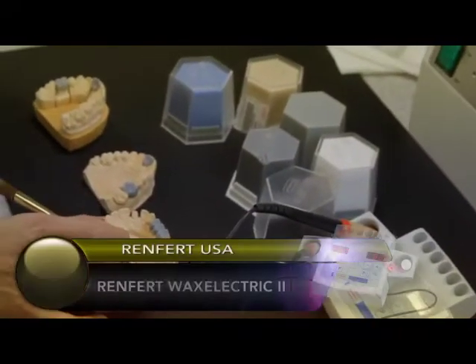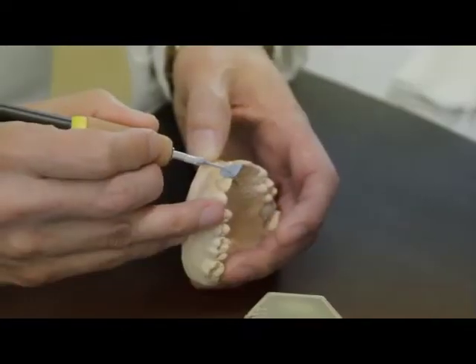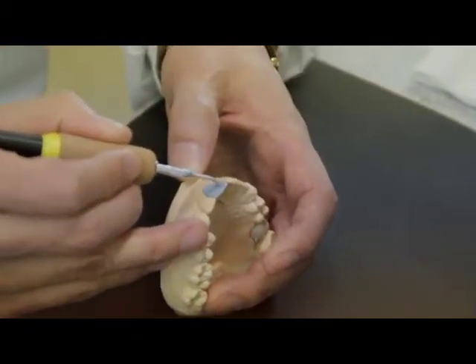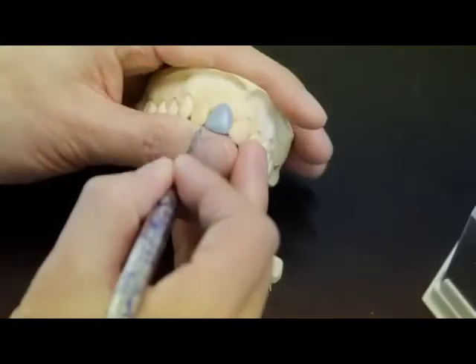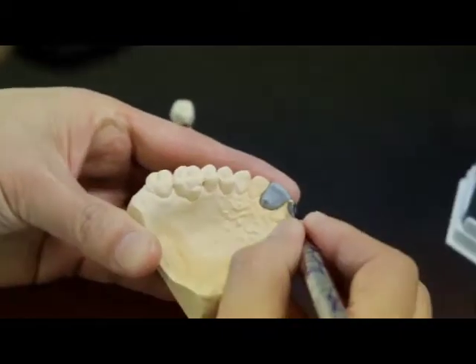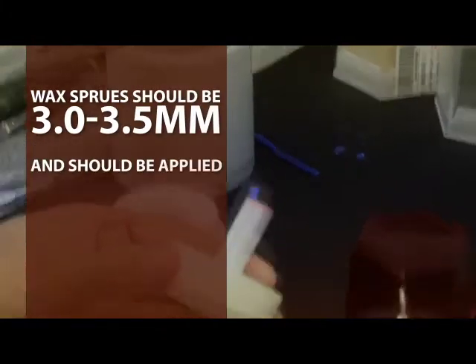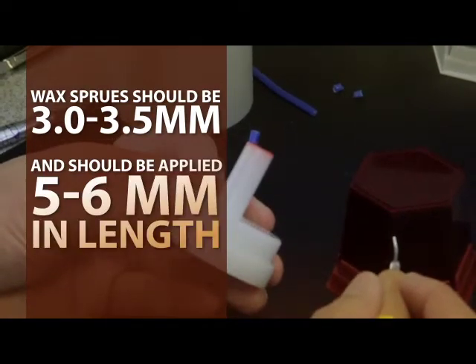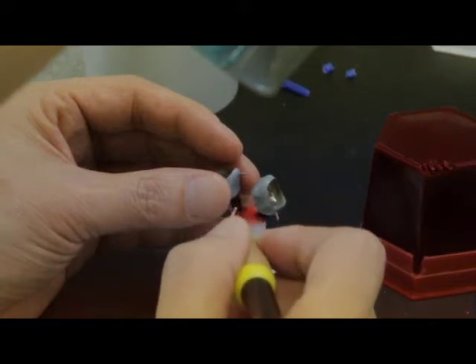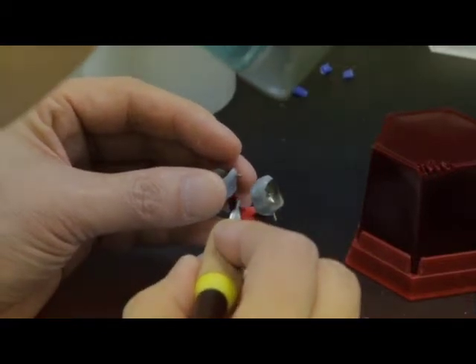After the opaque or power frame modifier firings, the restoration is ready to be completely waxed up to full anatomical contour and function. The minimum thickness for both labial and buccal for pressed restorations should be 0.8 millimeters to reach an acceptable aesthetical end result. The wax sprues should be 3.0 to 3.5 millimeters and should be applied 5 to 6 millimeters in length. They should not taper towards the pattern. The pattern should be rounded out with no sharp edges. Consider the direction of flow of the ceramic material.